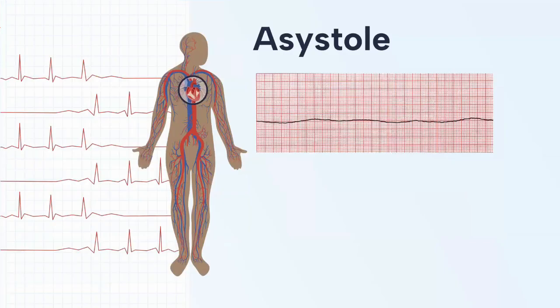And then the last one is asystole. So this is just a flat line, the typical flatline rhythm you see in the movies when someone passes away. There isn't really much to say about this besides just make sure you turn up the gain on all 3 leads of your defib machine or your monitor, just to make sure you don't have a fine VFib rhythm that you can shock. You want to also give adrenaline and see if you can go into any one of those rhythms and see if you can get ROSC that way as part of your ACLS algorithm.